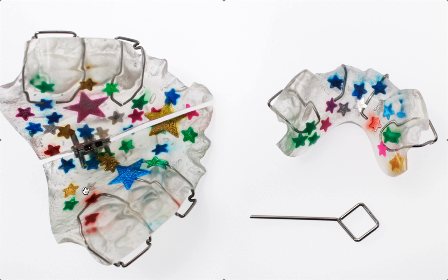This is your standard MacNamara twin block, which is going to help if you have a crowding case where you need to grow a jaw. That's what MacNamara twin block is for. Crowding cases in the mixed dentition where you need to grow a jaw. So you are not putting braces on it, but you are expanding the arches at the same time that you grow the lower jaw. So you're killing two birds with one stone, which is nice.